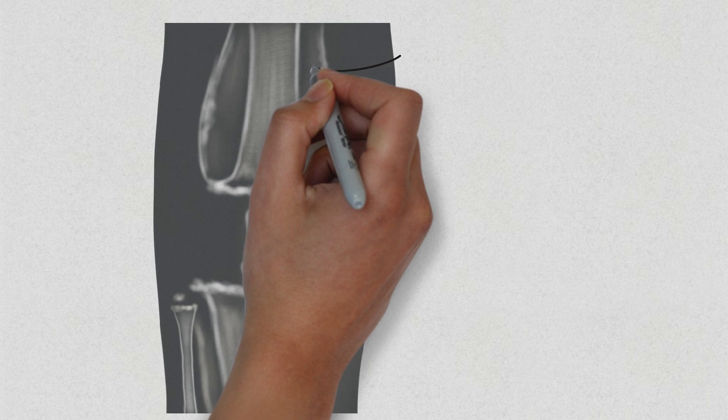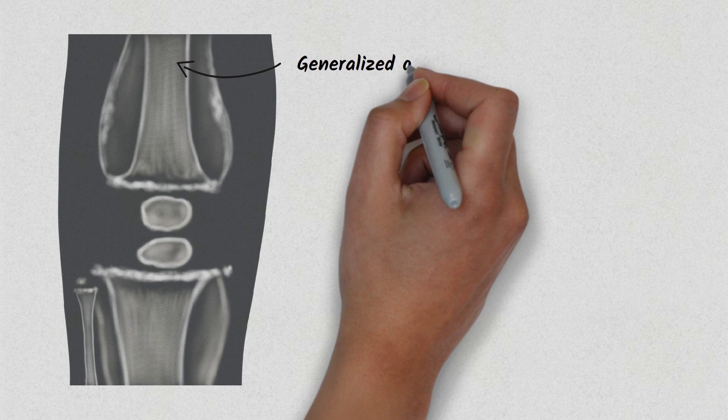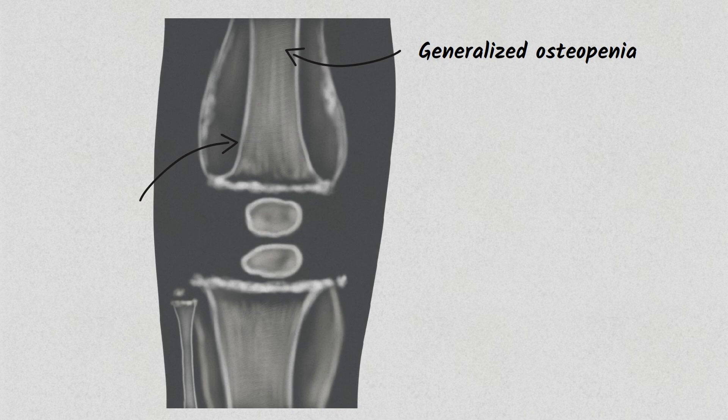First thing you can see here is generalized osteopenia with ground glass-like appearance. Next, you can see cortical thinning which is called pencil point cortex.